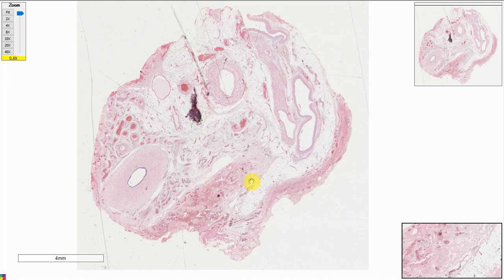But on histology, I'll show you the nerves as well, and if we're lucky, we'll see a cremaster muscle. It's skeletal muscle with skeletal muscle fibers. It also consists of the tunica vaginalis, which is just connective tissue and surrounding fat.